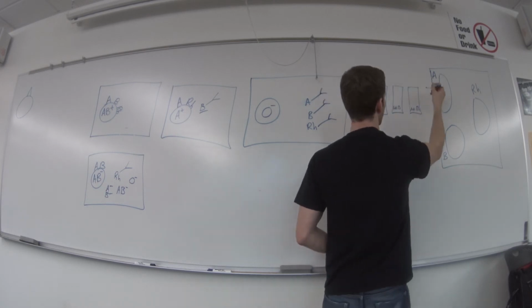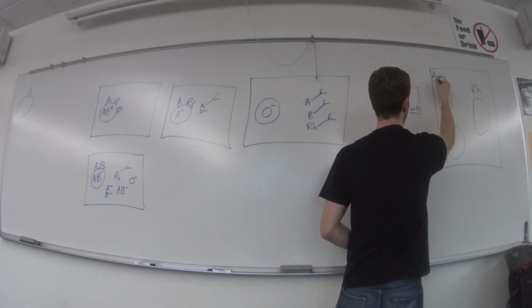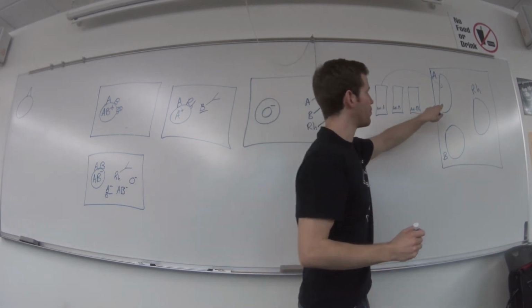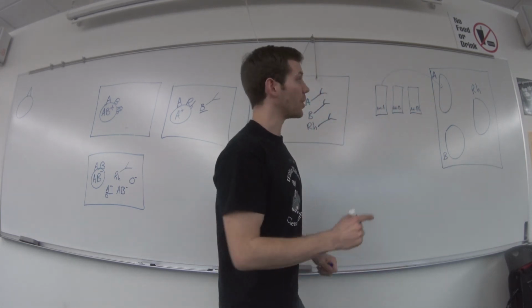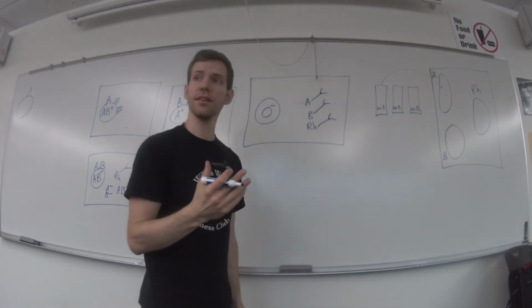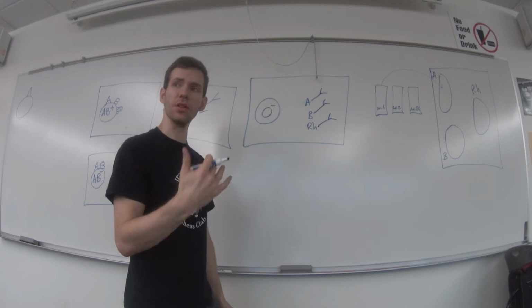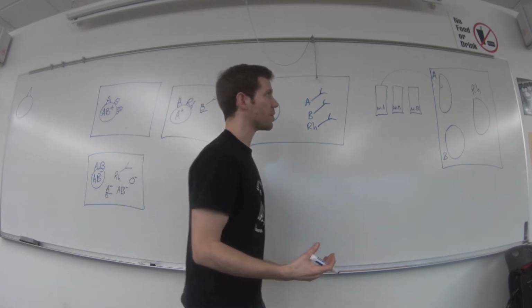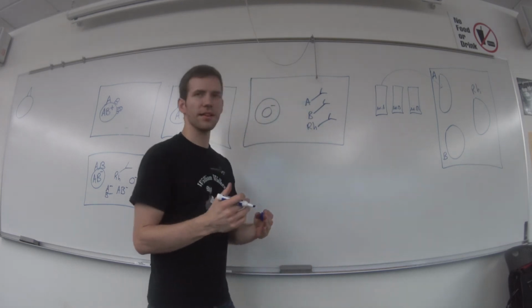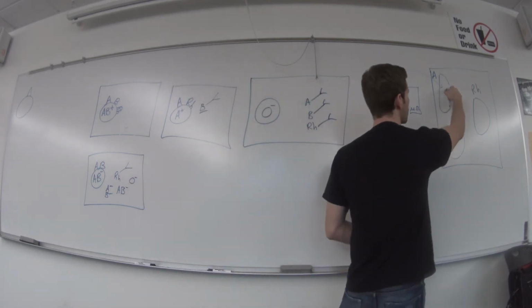And you're just going to take a drop from the A and put it into this blood. So this is the antibody for type A blood. So if your actual blood type is A anything, you will actually have agglutination. And so those of you who know your blood type now, if you have an A in it, then you should expect to see agglutination in here.